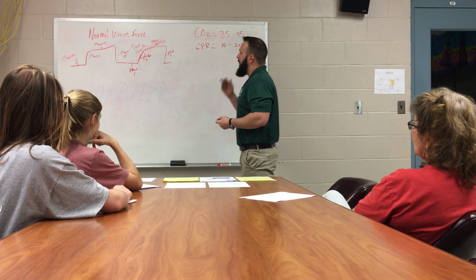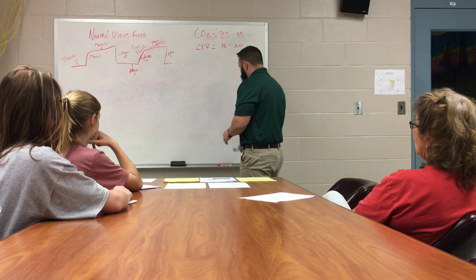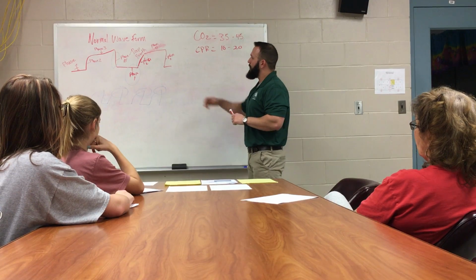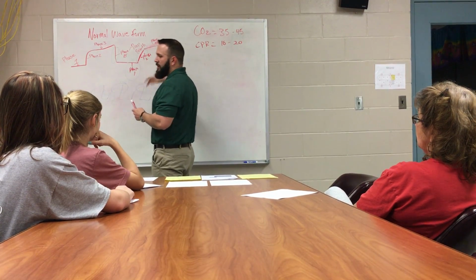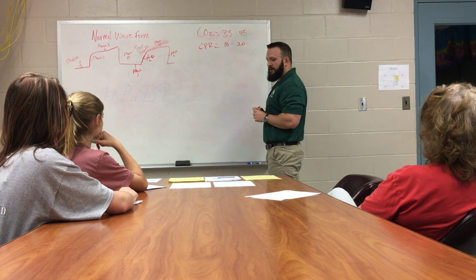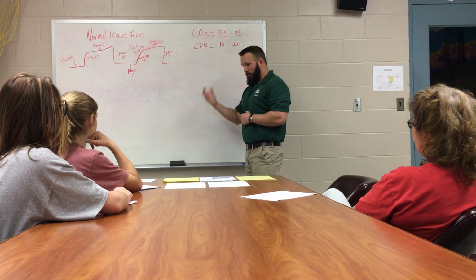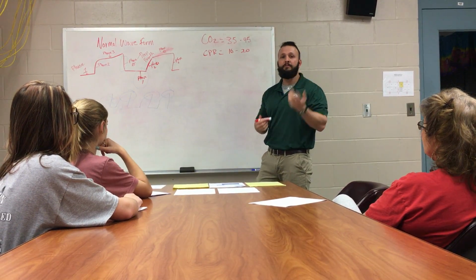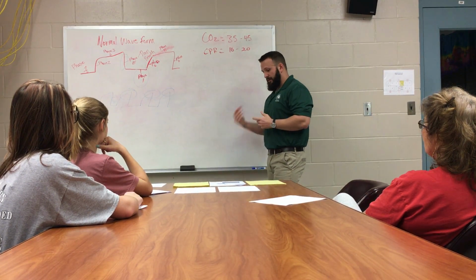So that's one way. Another way that this could help out the nurse is, let's say that we're in a PACU or we're in an ICU or CCU and our patient's intubated, and we have our normal waveform pulling up because we have our ET tube. It has the little piece on it that we're able to monitor our end-tidal CO2. We have our normal waveform. We have our normal values of 35 to 45, and we're watching our patient. So one thing that we have to worry about is the tube coming dislodged or the patient extubating themselves by accident. So how can we know that?